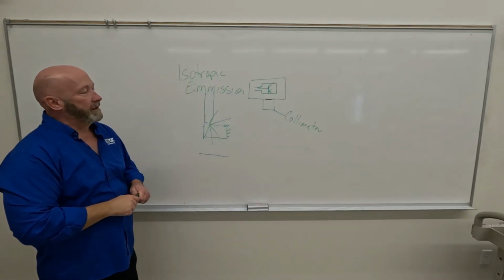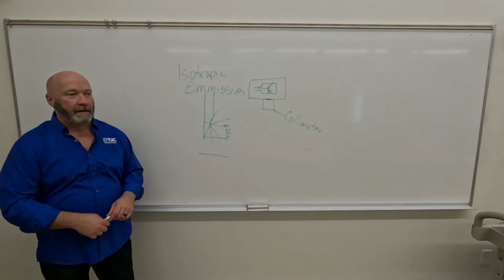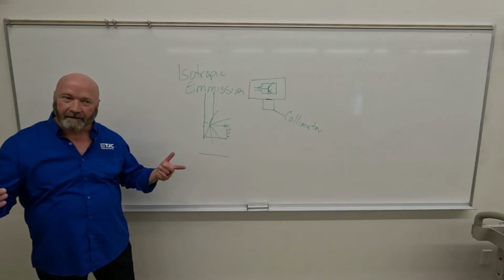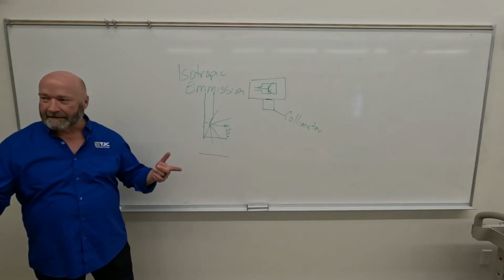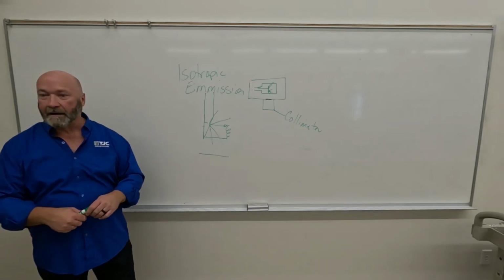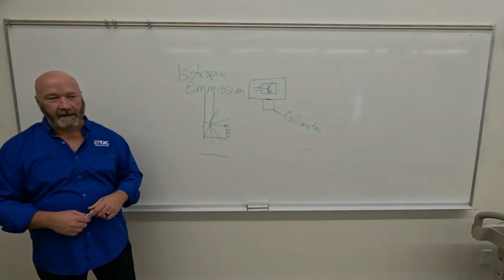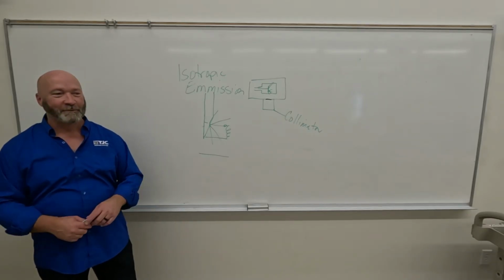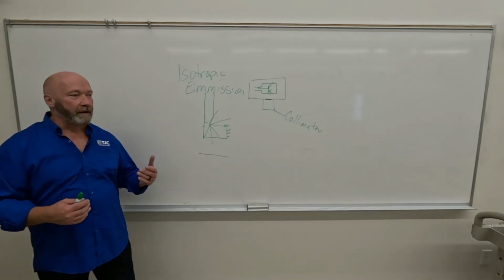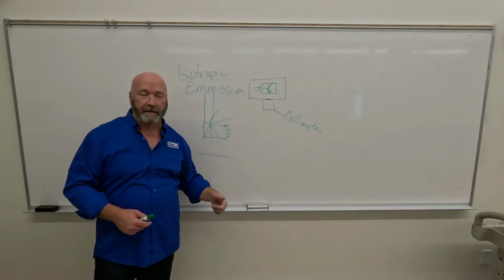And potentially, if you're in the room, if you look back to chapter 1, the kid getting his arm X-rayed, and the other picture of Edison in the fluoroscopy where the X-ray tube is inside what looks like a wooden box. Where are those X-rays going? Everywhere. Everybody in the room is getting blasted, right? So we don't want that. We want to limit the X-rays just to what's coming through the window and eventually hitting the patient.